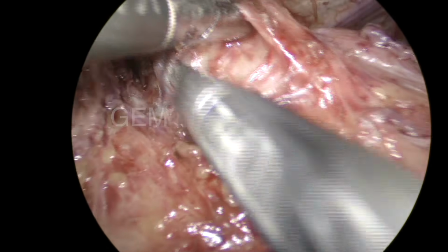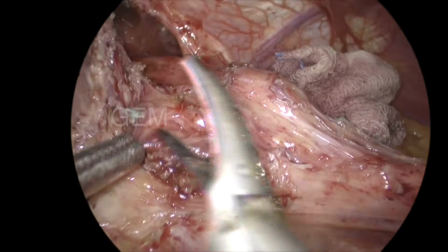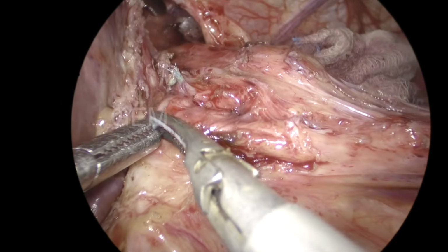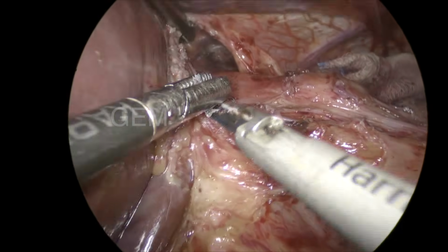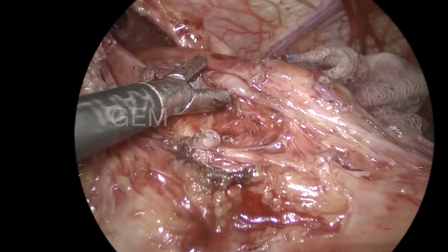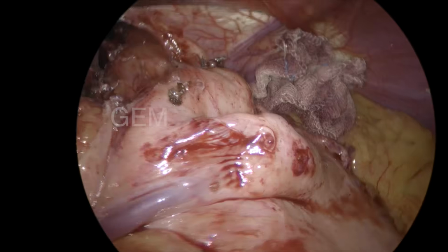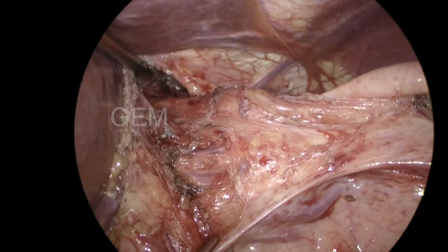I started lateral dissection. You can say I divided some suture. Maybe the fundus of stomach, posterior wrap, they fixed here with the crus, posterior fundus, to prevent the transmigration. But in this case, that has not worked. The entire wrap has migrated inside the hiatus.